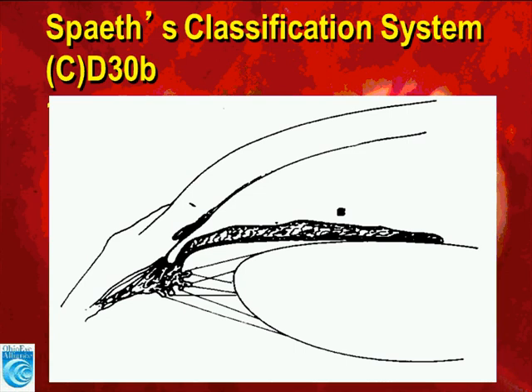The parentheses are in order to help us differentiate compression versus non-compression gonioscopy. What is seen without compression is within parentheses, and what is seen with compression is next to the parentheses. So without compression in this angle we can see scleral spur. With compression we can see ciliary body. We believe this angle is open about 30 degrees, and the configuration is bowed anteriorly.